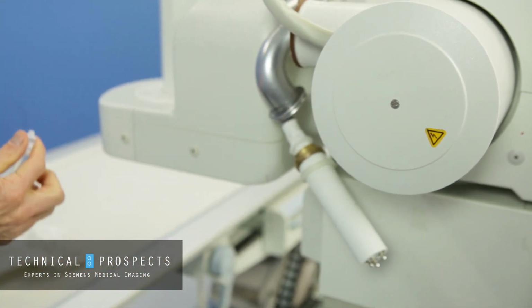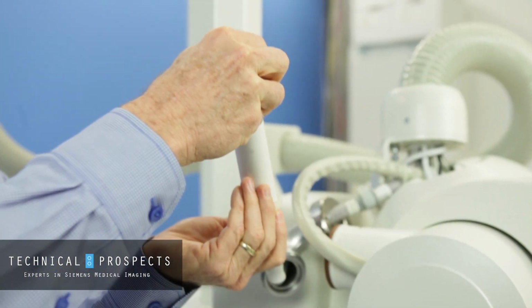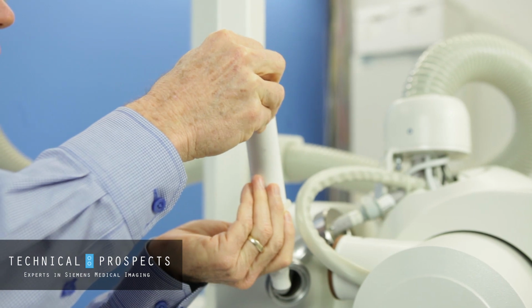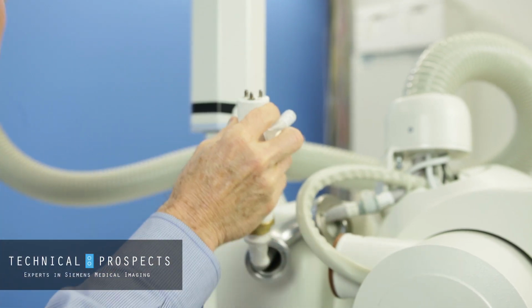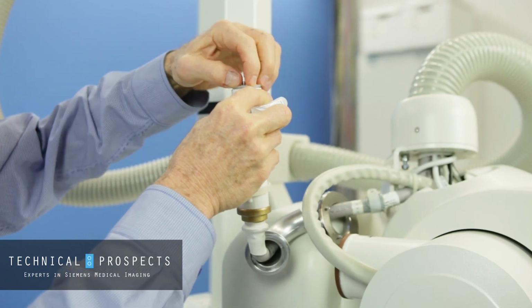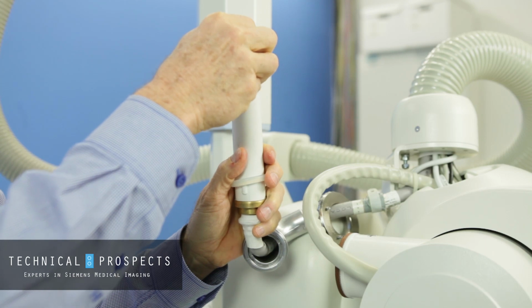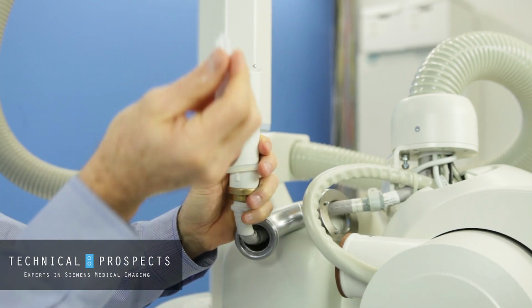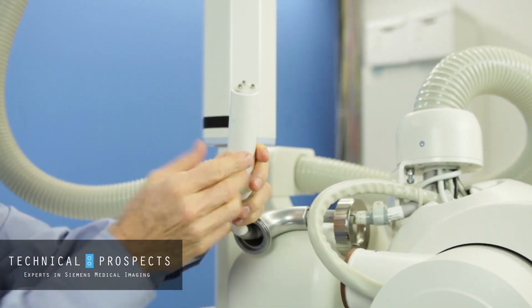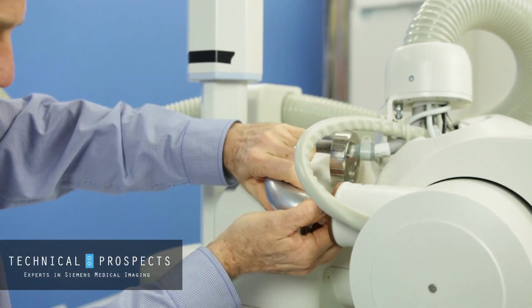To install the discs, take some oil, put a little bit on each one. Make sure you get enough where it provides a little bit of a seal, then put a little bit on top. Usually, half a bottle of oil is fine, so you can do both sides of a tube with one bottle. Then put it in.